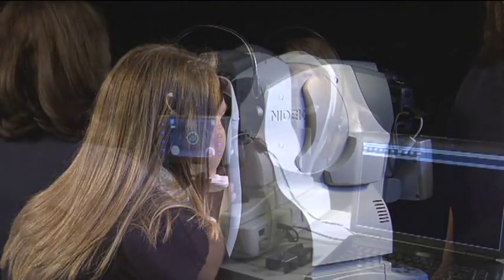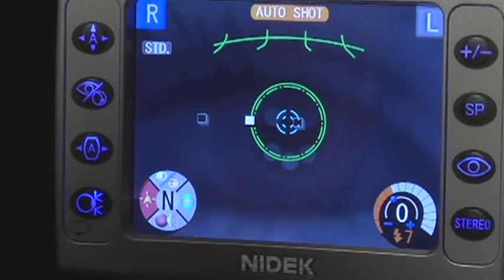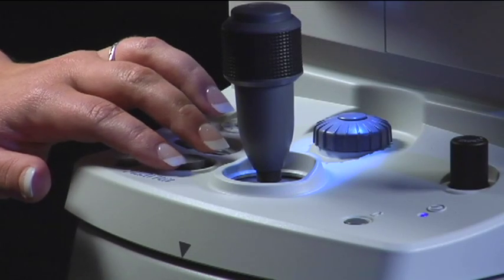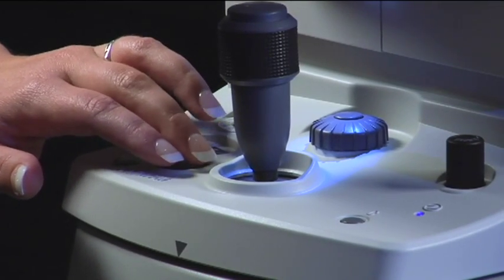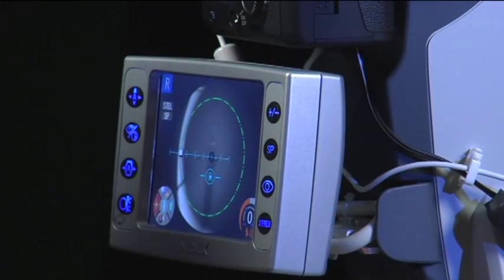When the patient is ready, press the stereo button, which is the fourth button down on the right side of the LCD screen of the AFC. Move the fixation one click out to the periphery for each eye by toggling the fixation button. The optic nerve should be near the center of the image after adjusting the internal fixation.